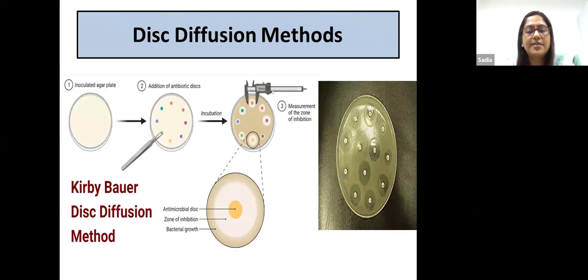These are the simplest and the easily available methodology for antibiotic susceptibility testing. The reason that they are so simple is because you do it on an agar plate and you take a manual reading. So the agar media that we usually use is Mueller-Hinton agar. The Mueller-Hinton agar, if you see here, normally without inoculation, it will look something like this. It will be clear. And on that, you will swab the organism that you have grown from the sample.